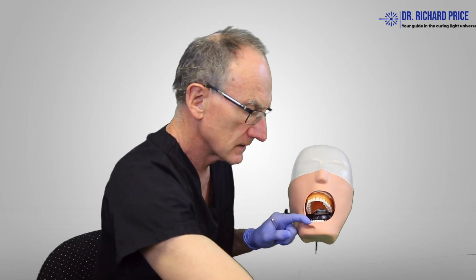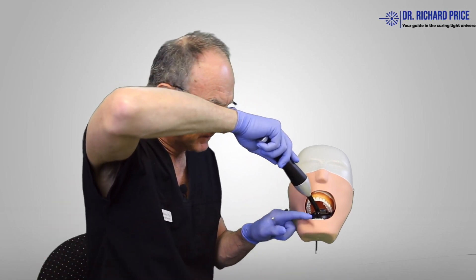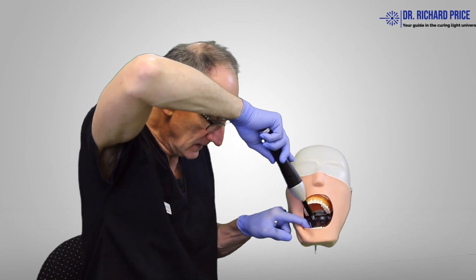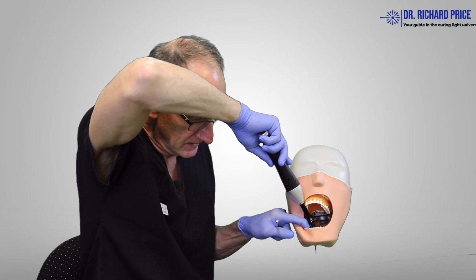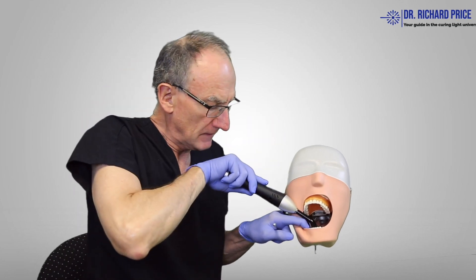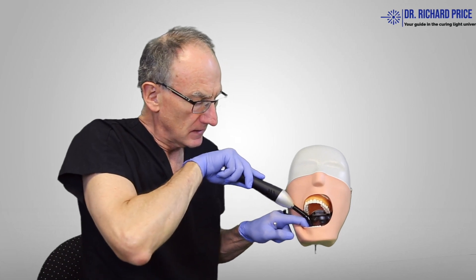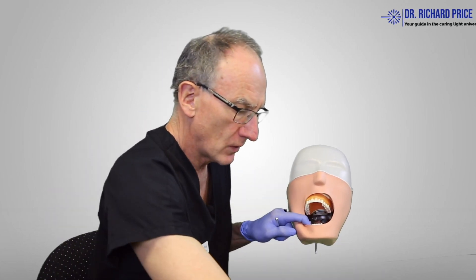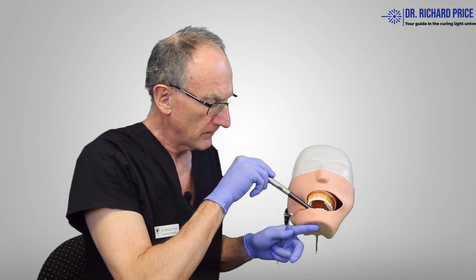Trying a different light, we'll see if we can get in there. I can't access that except from the top, so I'll get the patient to open up wide and I can finally kind of get in there, but it's really hard. You can see I'm having to contort my body to try and get into these lower incisors. Whereas with a curing light such as this, you can get in there very easily.